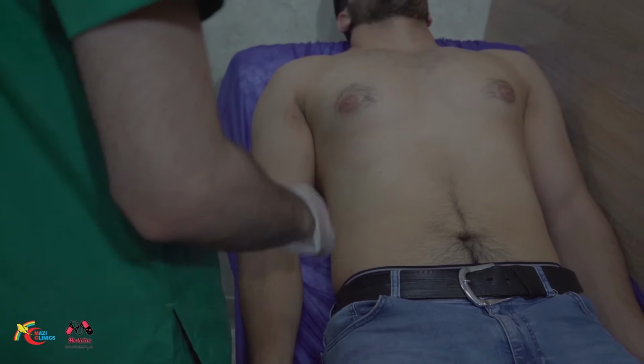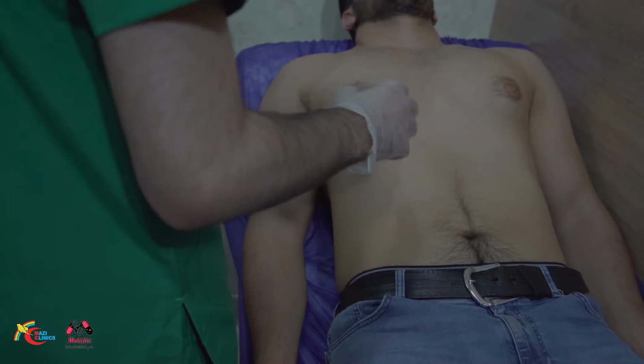Of course, yeah. Do you have any pain on your chest? No. Okay, I will palpate your chest in order to know where to locate the leads, okay?